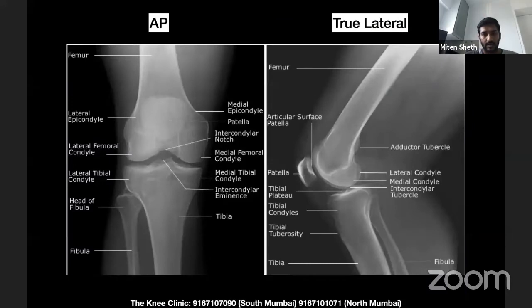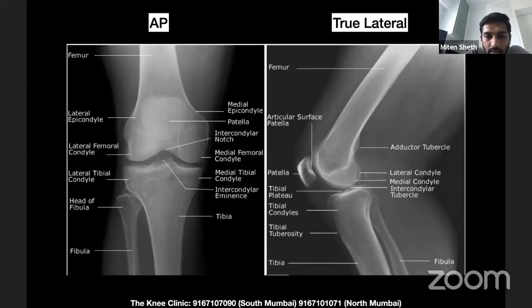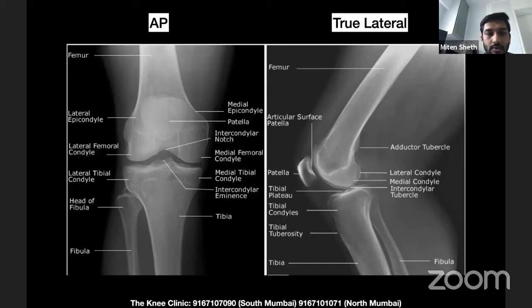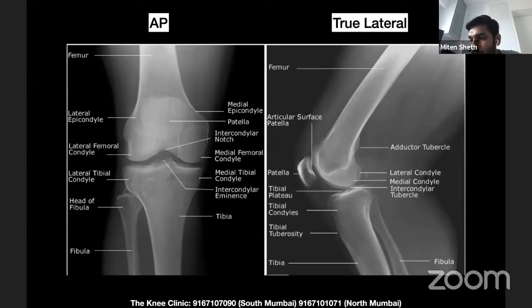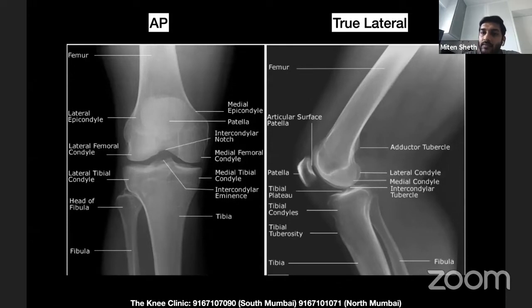A true AP radiograph means the patella is facing forwards in the center, and the fibula is bisected by the tibia — the fibular head traces in line with the lateral tibial plateau cortex. On the lateral side, a horizontal beam or cross-table lateral should show overlap of the femoral condyles, which is the most important thing to see. Good femoral condylar overlap also allows you to see the marginal patellofemoral space, confirming it is a good lateral X-ray.